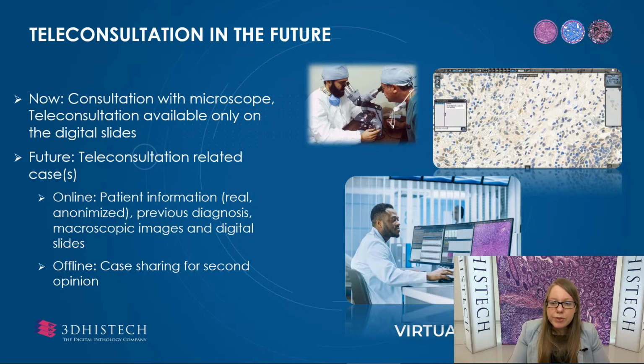Currently, consultation can happen with a traditional microscope or on digital slides with the viewer application. For determining the diagnosis or creating a second opinion, beside the digital slide, other case-related information is needed. Information like the patient's previous examination results, gender, date of birth, and macroscopic images. Because of this, in the future, the Case Manager will have a teleconsultation function which is capable of providing this information for a consultant.